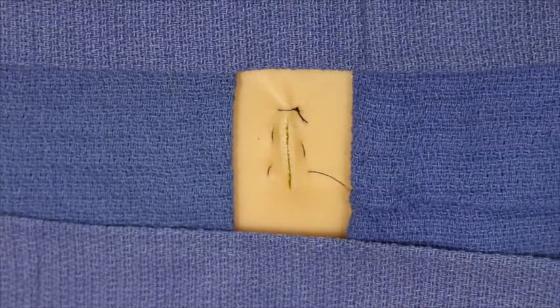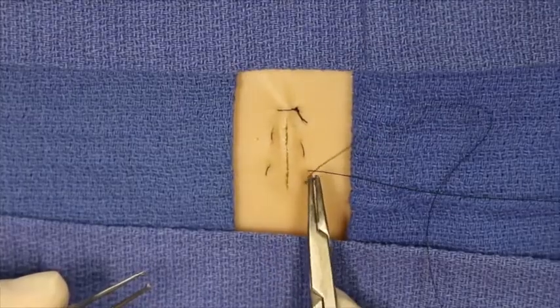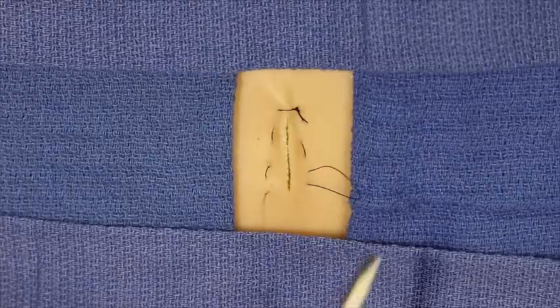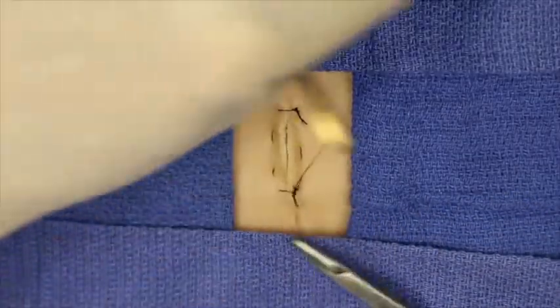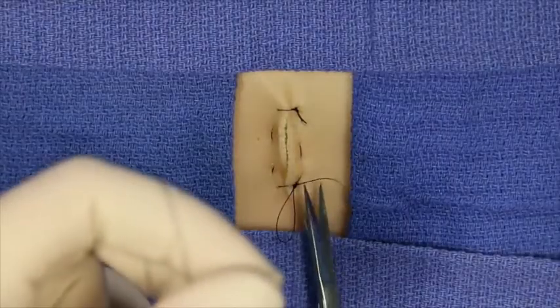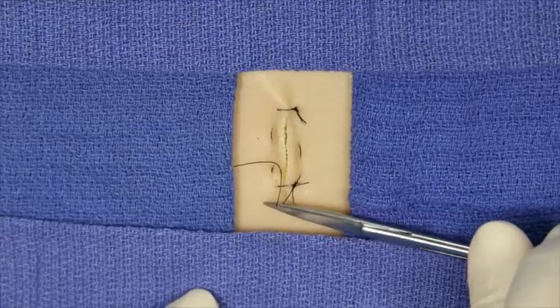This technique continues along the course of the wound until the end of the wound is reached, at which point an instrument tie is performed and the suture material is simply tied off. This leads to an everted wound edge, which is generally desirable, and reasonably good wound edge approximation.